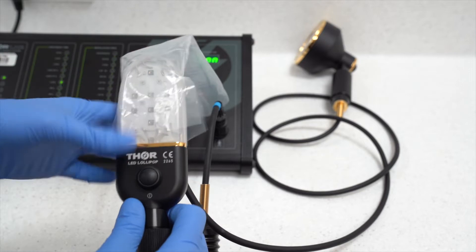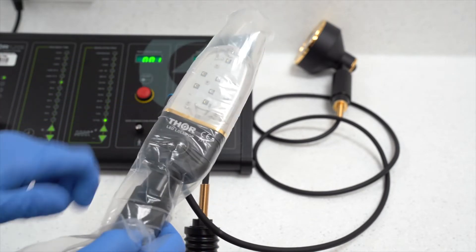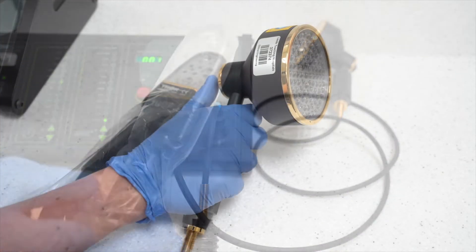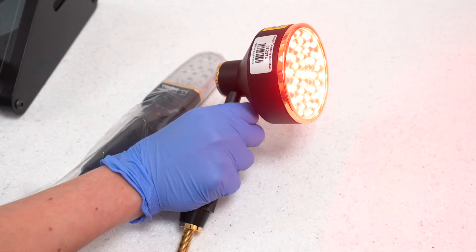Prior to use, the intraoral probe should be covered with a single-use plastic sheath. These are stored with the equipment. Pressing the button on the relevant probe will activate the probe for the treatment time set.